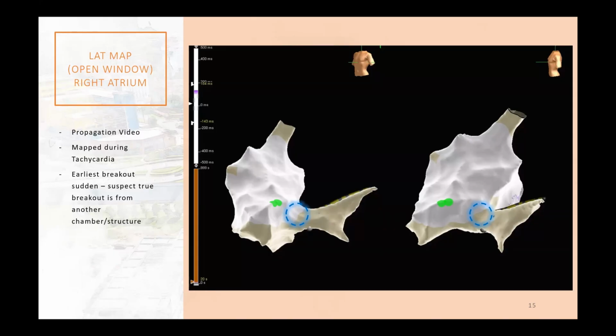It gets a stenosis quickly because veins are not supported by musculature. That's what we experienced in the early days of pulmonary vein stenosis, because we burned inside the pulmonary vein with RF. So irrigation should be much better because it creates a deeper lesion, and also irrigation keeps the tissue cool. So I think posterior septal pathways, right posterior pathways, should mostly be ablated with irrigation.